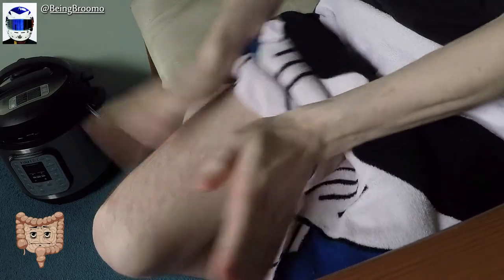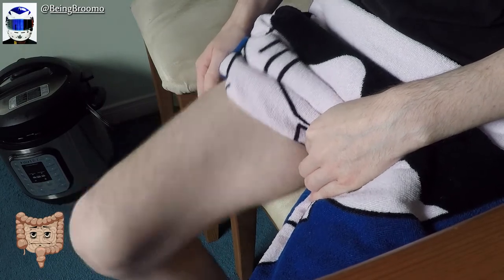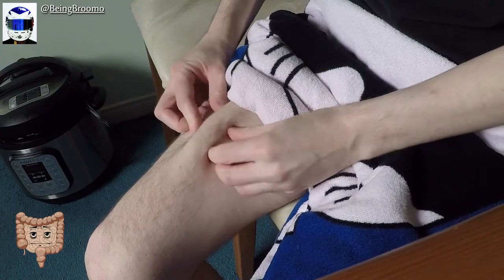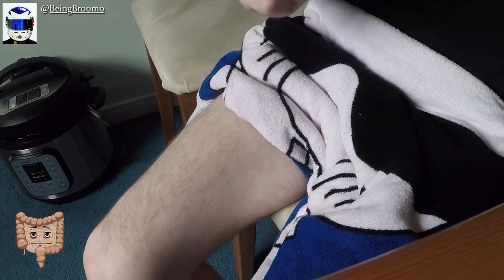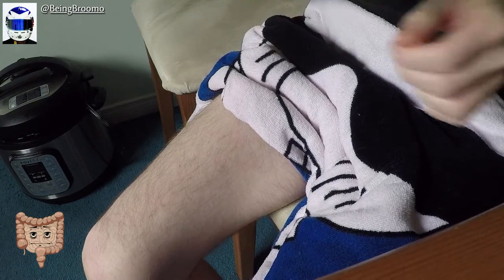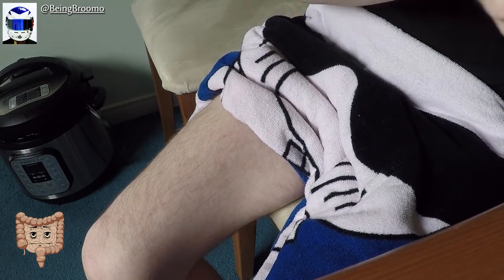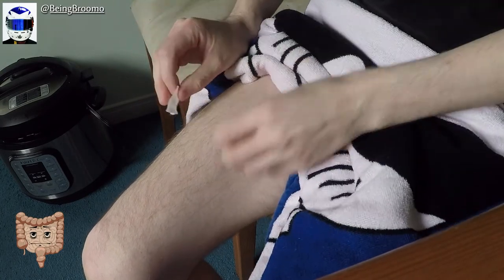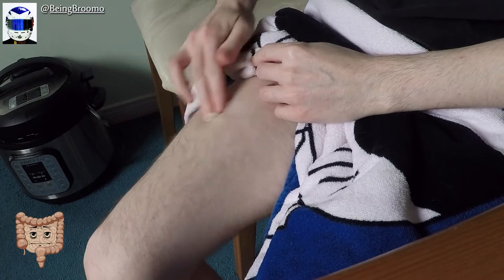So there is a wonderful white thigh with no body fat, just floppy muscle and skin. I need this stuff right here — that's what we're going to do that in. I'm really hoping this doesn't hurt. So we have one of the wipes. Some people think these don't work, other people think they do. I think they smell like alcohol, so why wouldn't you want to rub it on you? I'm just going to do a generally large area.